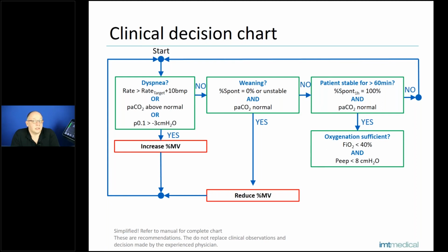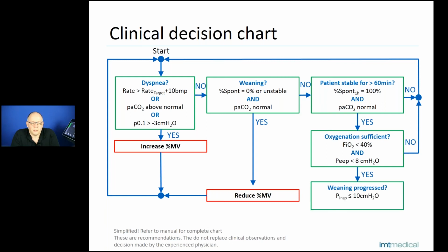And for the end, the implementation of AVM, if some clinics are interested in, we would like to start with AVM, there are some rules to follow, and the most important one is everyone in the team should learn something about AVM. If the nurses are excited and want to use AVM and the doctors are not convinced, AVM won't be a success. So all should be inside this and all should be trained on AVM. If not, in my experience, it doesn't work very well.